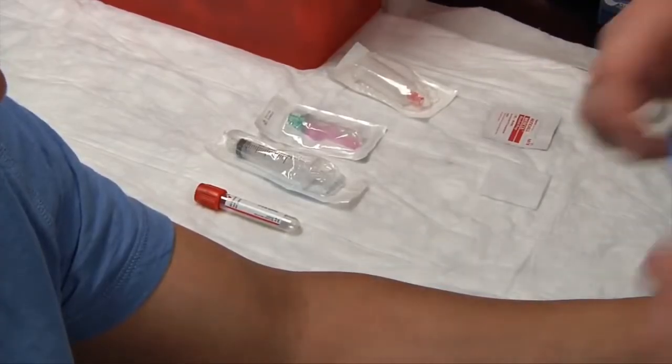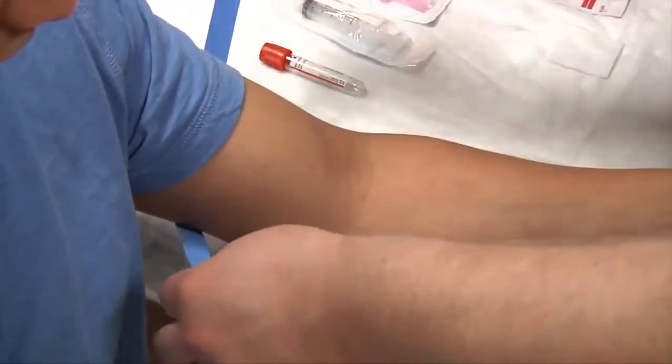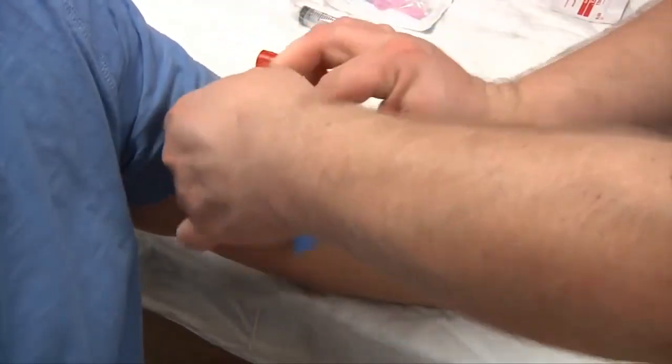We'll need our tourniquet. Go ahead and apply this now. I've already asked my patient for consent and also explained the procedure. And I've previously washed my hands.